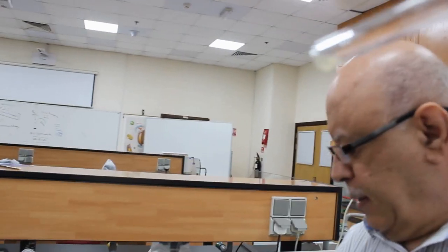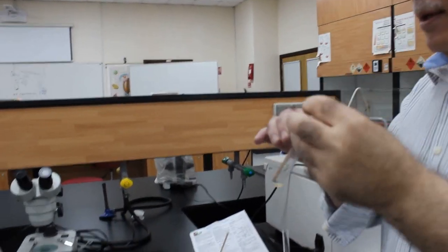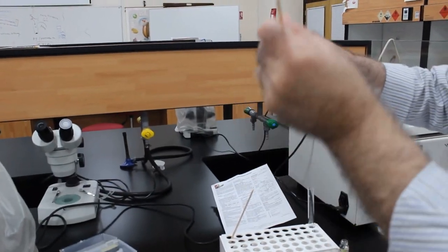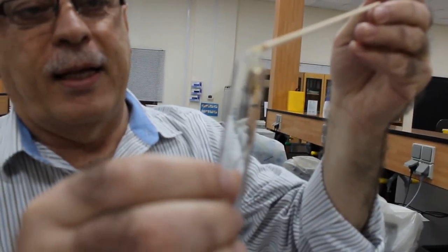I don't know if you can see it. I doubt if you can see it, but I'll show it to you very soon. A fibrin clot. It clotted around 12 seconds. Let me show it to you in a minute. All right. Can you break one of these things? All right. See this? See the clot? It's real. You can tell. This is a clot.